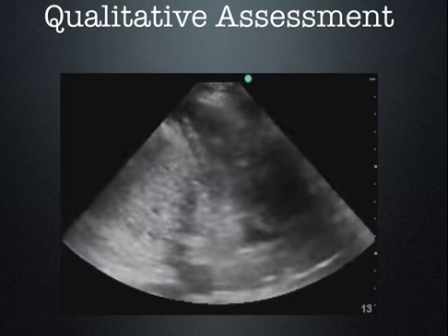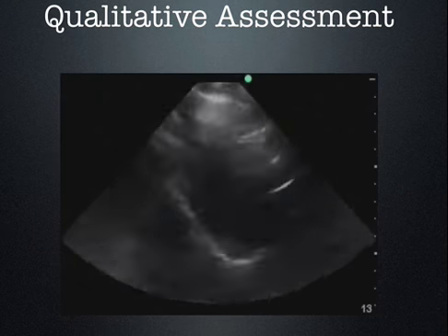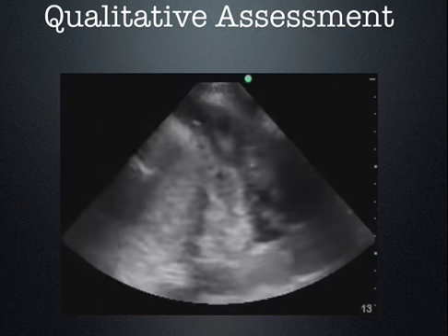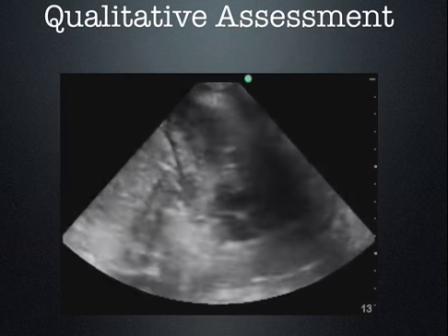All right? Lastly, how about this one? Here's the LV right here. Now this is an oblique cut. This particular patient didn't have a great parasternal nor apical window. So this is kind of what I was telling you just a second ago. They're not always going to have those pristine windows, and you can't always roll the patient over like the cardiologists do to do all your echo scans. Okay? So we have to do the best we can with what we've got. This is clearly a hyperdynamic LV. All right?